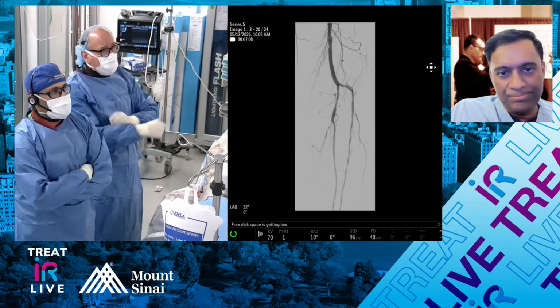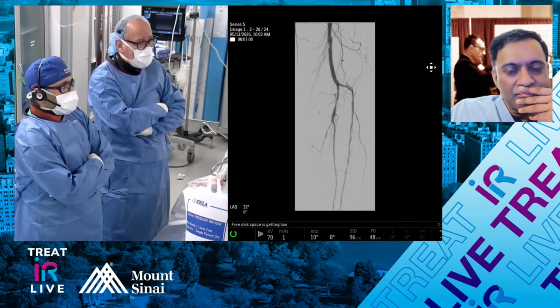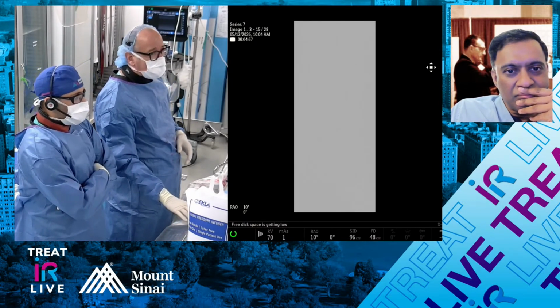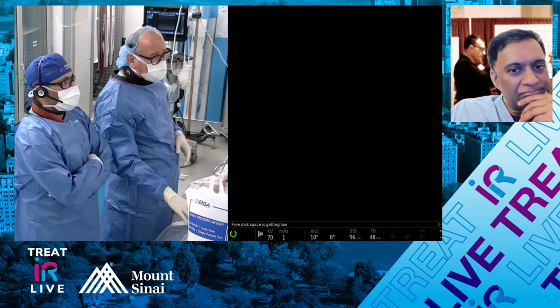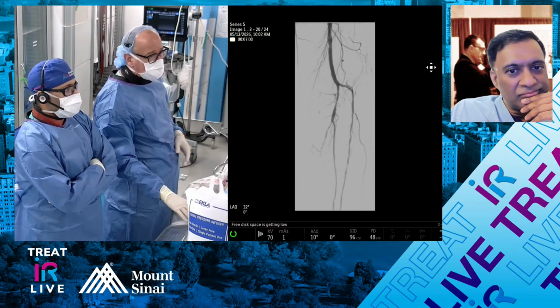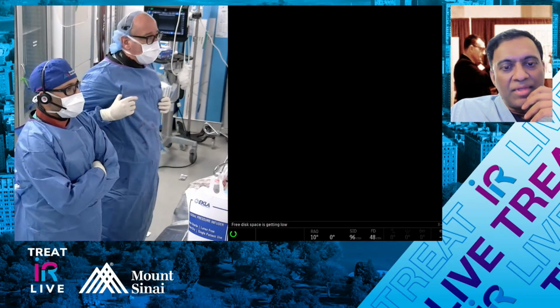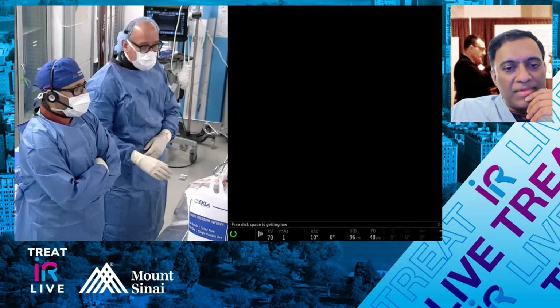And we could do a lot here, and obviously it's not a black and white case. I want to ask, in your practice, how would you manage this? I'll just give you the picture that I'm thinking of here when I think of how I'm approaching this. I think this is the so-called money shot, right? So what would you do? Would you do one vessel? Would you do two vessels? Would you do three vessels? How would you approach this?